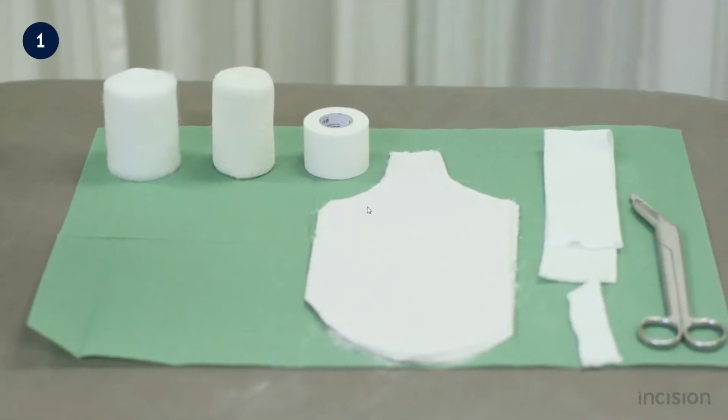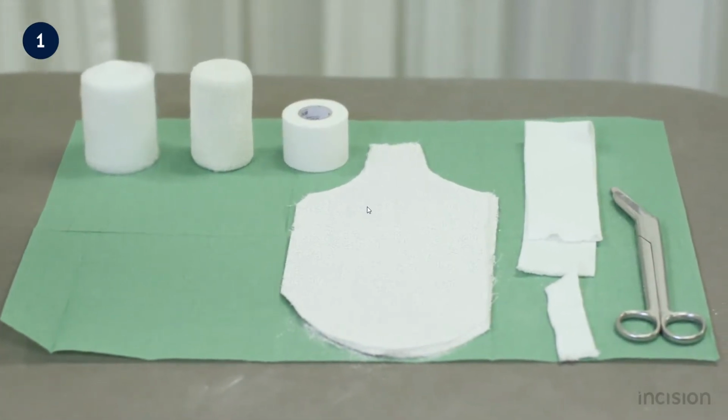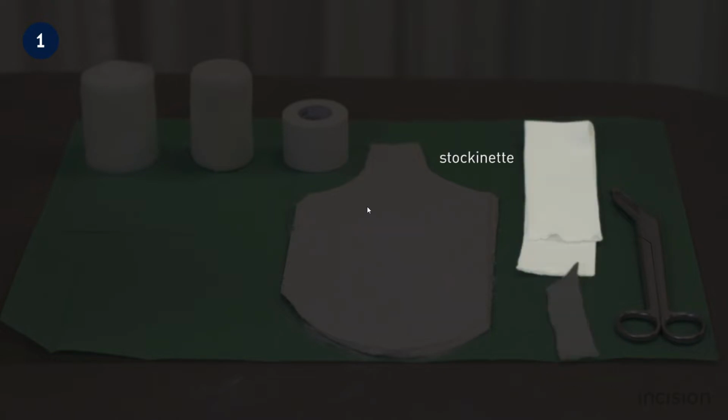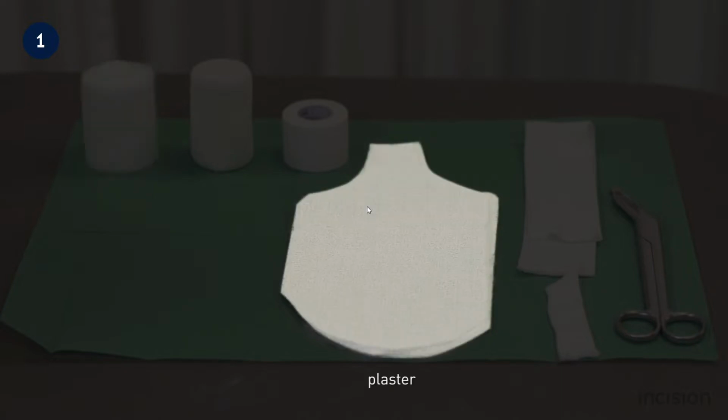The following materials are needed to apply a thumb spica splint: one small stockinette with a width of 2.5 centimeters. Note that one side is cut obliquely. A stockinette with a width of 5 centimeters. Padding with a width of 7.5 centimeters. Plaster. For an average-size adult, 8 to 10 layers of plaster should be sufficient.